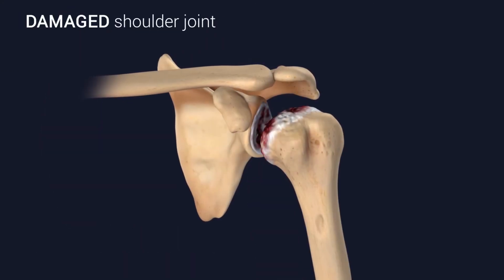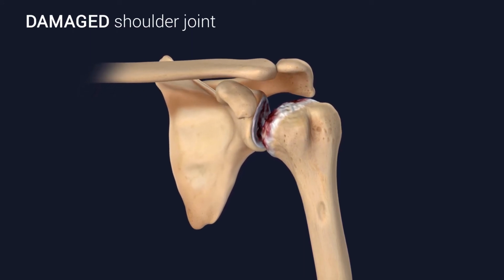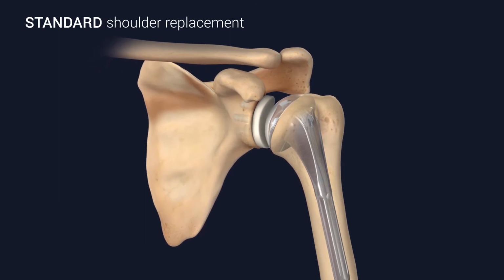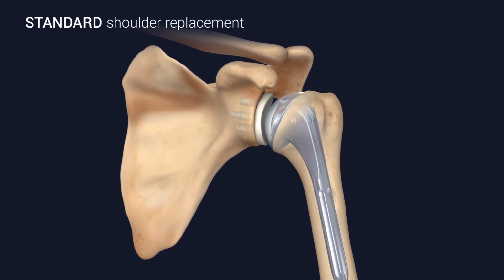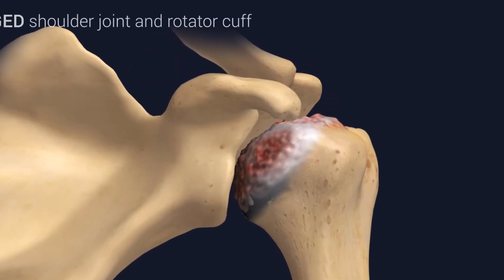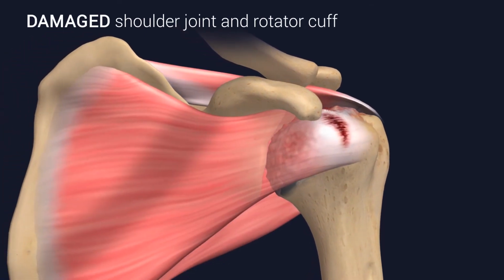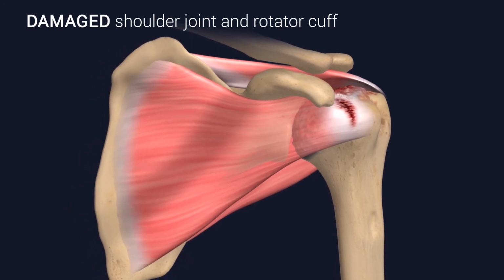Severe disease or injury of the shoulder joint may need to be treated with a joint replacement. A standard shoulder replacement uses manufactured materials to create a new ball for the head of the humerus and a new socket for the scapula. However, when disease or injury of the shoulder joint is complicated by a severely weakened or injured rotator cuff, a reverse shoulder replacement may be necessary.